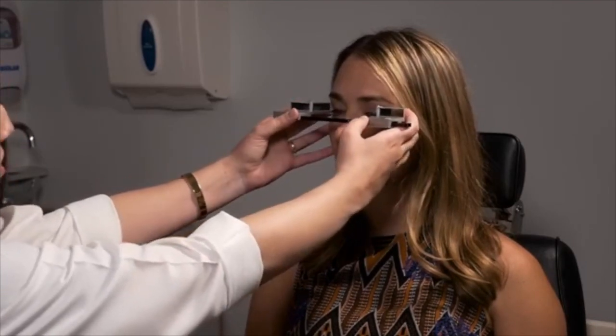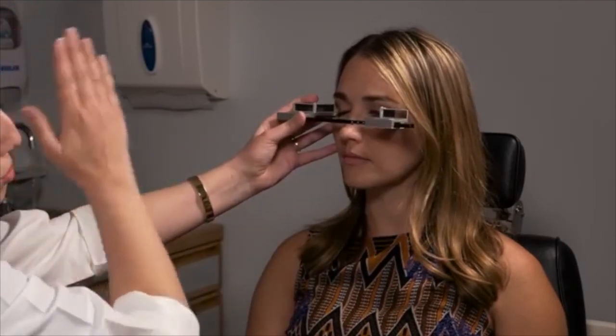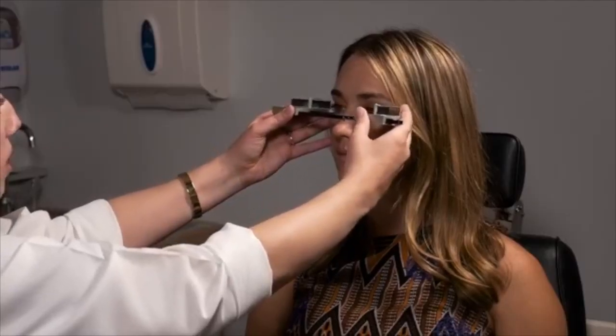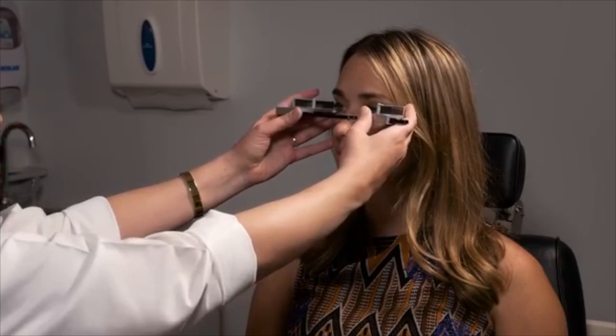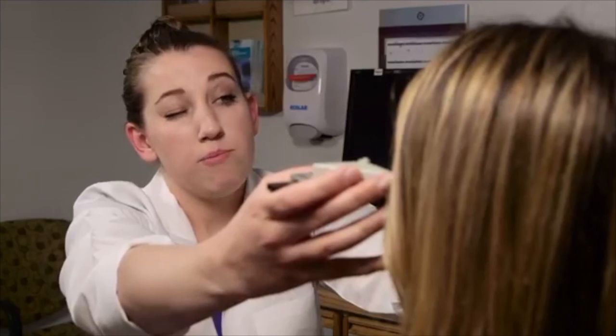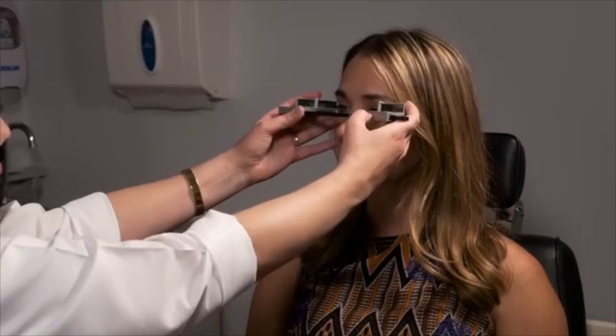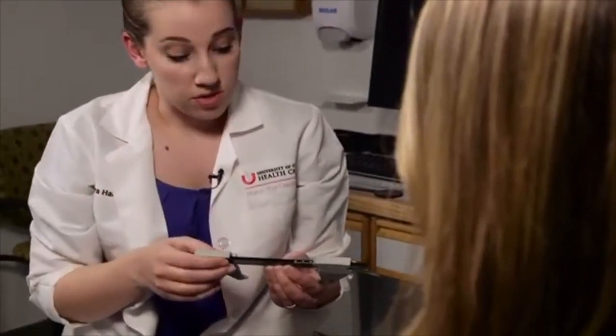So while the patient is positioned that way, you close one eye, look in the mirror, and you'll see two red lines. The point of the red lines is to eliminate parallax. So you line those two up when you're taking the measurement. You look in the mirror, and you can see the corneal apex. And so you just use one eye open, ask the patient to look at your open eye, and you mark in your head where the corneal apex falls. You do the same thing on the other side. And you always want to make sure that you take the base measurement. This is the distance between the two index points.